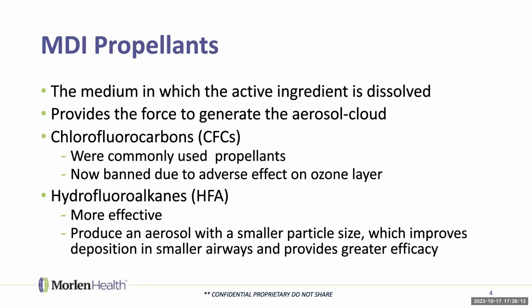So what's important about all that is that the gas that's in the chamber of the inhaler is going to push the medicine out of the inhaler, and you need to then breathe it into your lungs. It's coming out whether you're breathing it in or not. Okay, it can go out in the air or it can go to the back of your throat. We'll tell you how to breathe it in so that you coordinate the inhalation, breathing in as that gas is pushing the drops of medicine out, and you are inhaling them into your lungs.